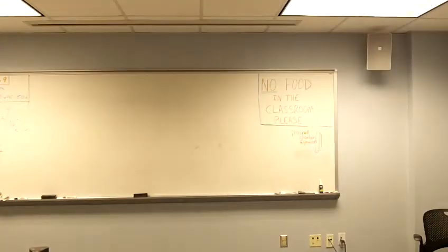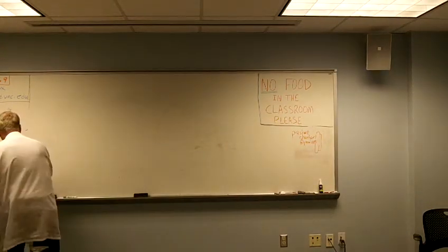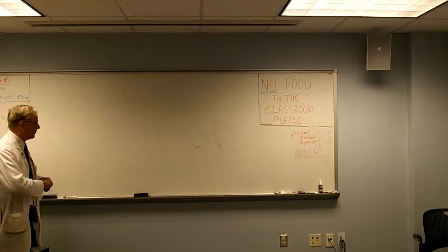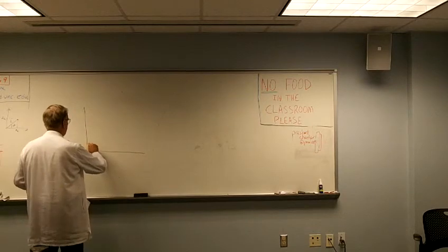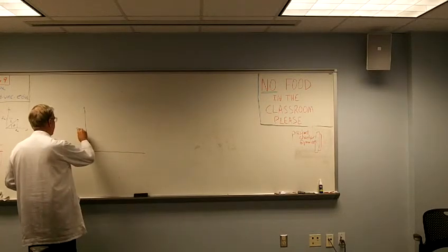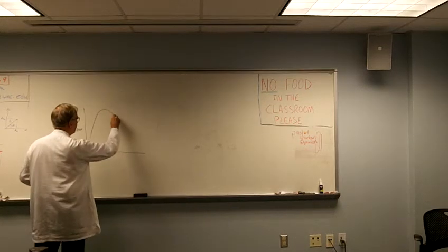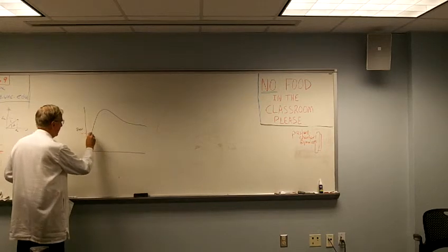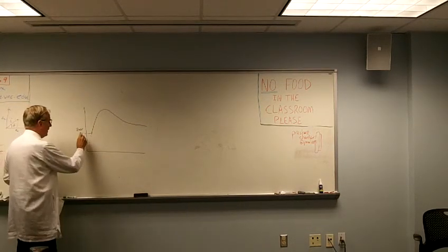Now this, if I lose you in my explanation, speak up, because this is pressure, and this is the typical profile of pressure in the aortic root. This is the point where the aortic valve opens.